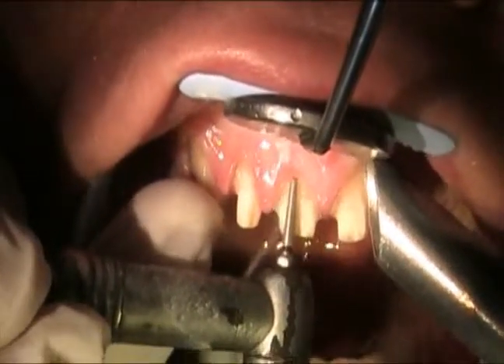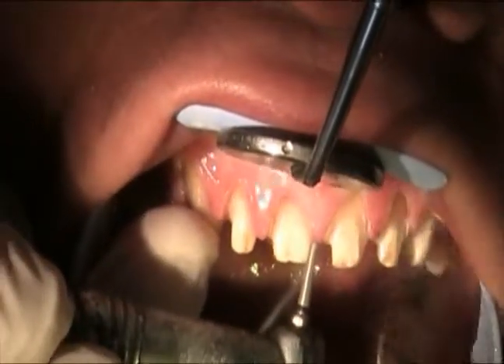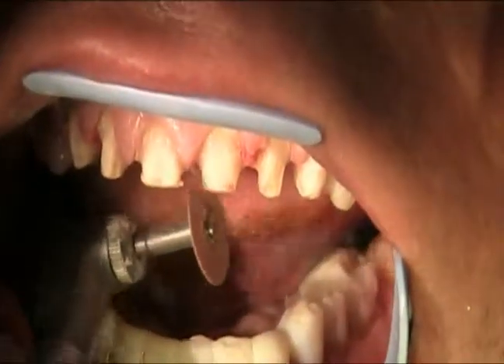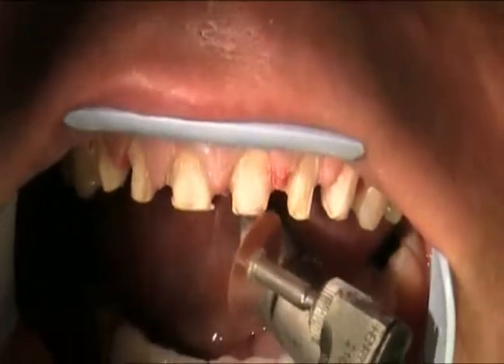So we'll go through and get all those edges smoothed right around the margins. That's the extremely important part of the preparation for the teeth. And we'll round all the corners here at the end, make sure there's no internal stresses that we'll put on the porcelain — it could cause some premature fracture.